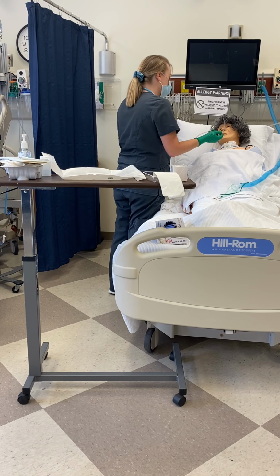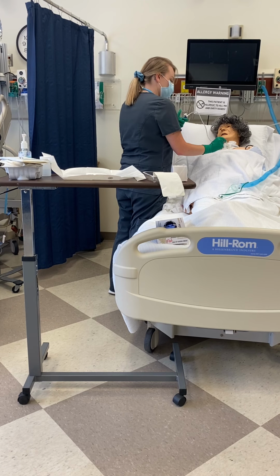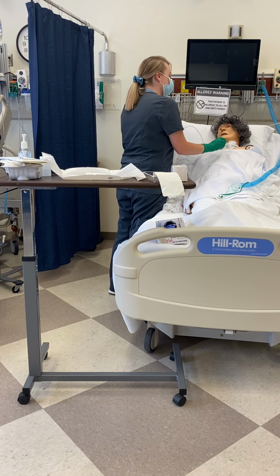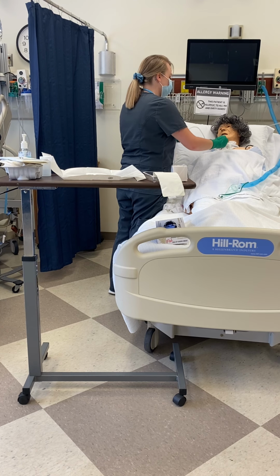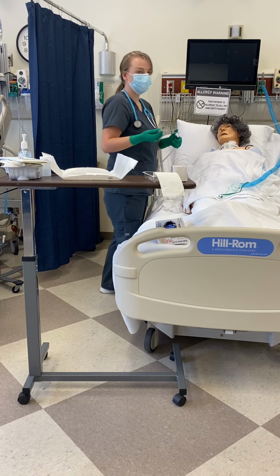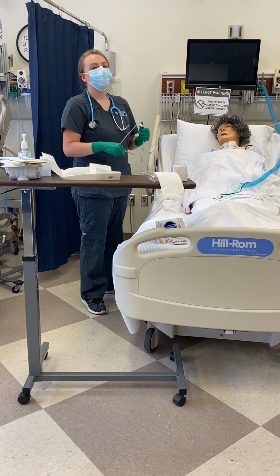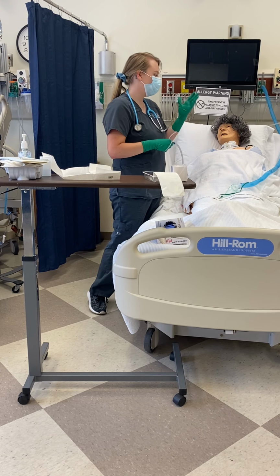Alright, I'm going to insert this in your trach, making sure the suction's not on until I meet resistance. And then once I do, pull it out, intermittent suctioning for 10 to 15 seconds, and I will repeat this until there is no more mucus or phlegm and it is all cleared out.